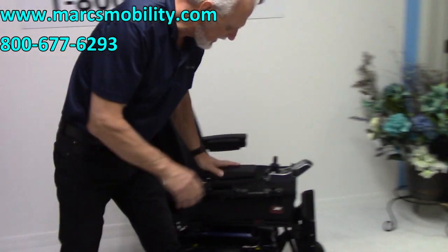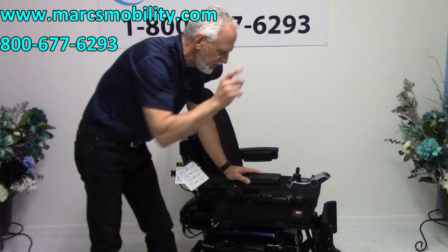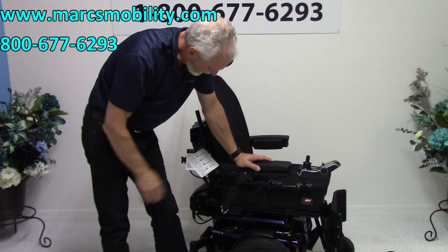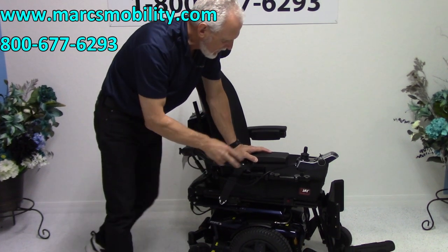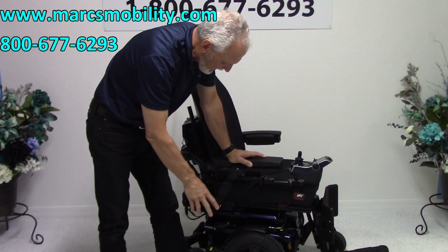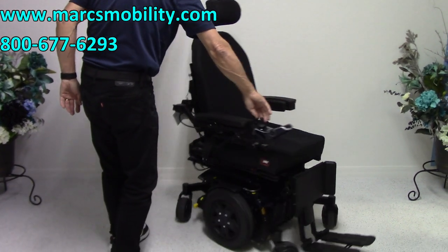This chair has the 12-inch seat lift and the electric tilt — the two main functions. The legs and the back are manual. This chair has two miles and it's a mid-wheel drive, so when you go in a circle it has a really good turning radius.